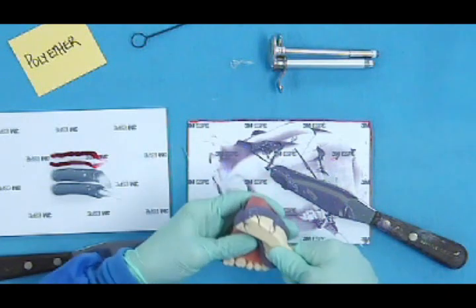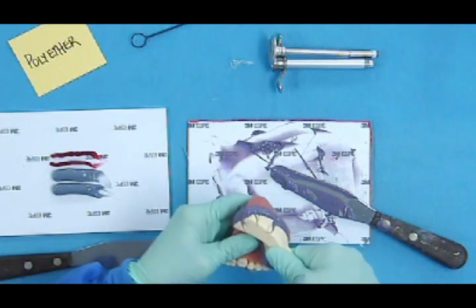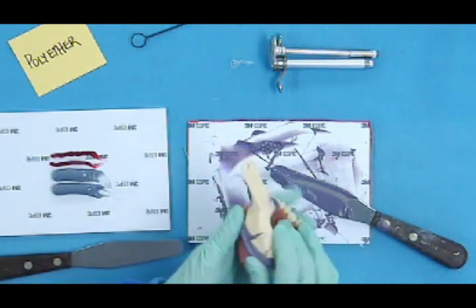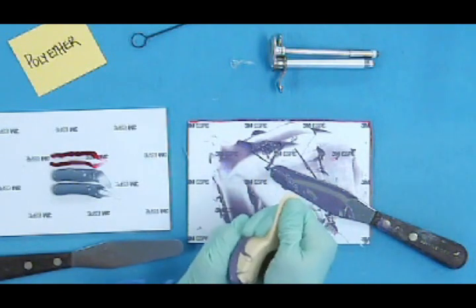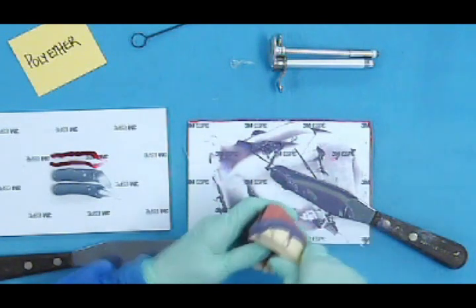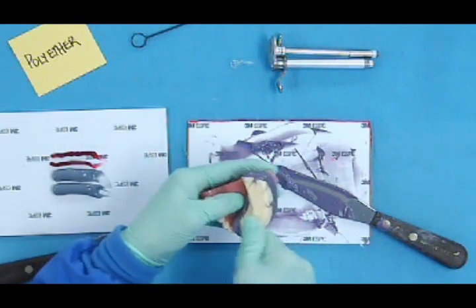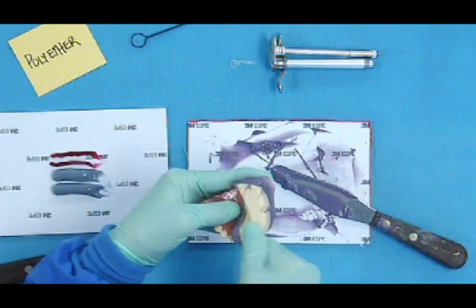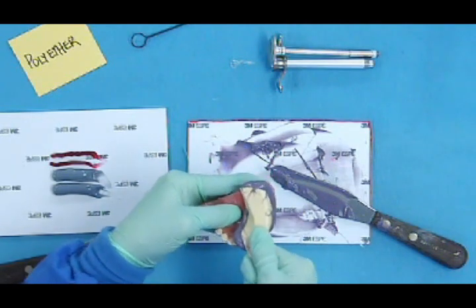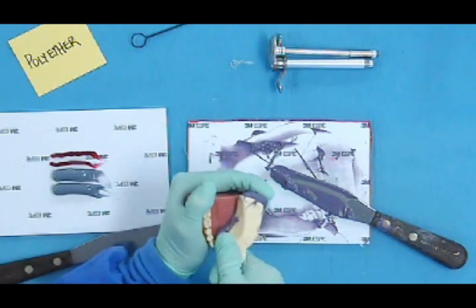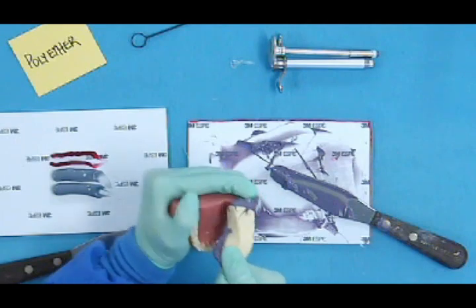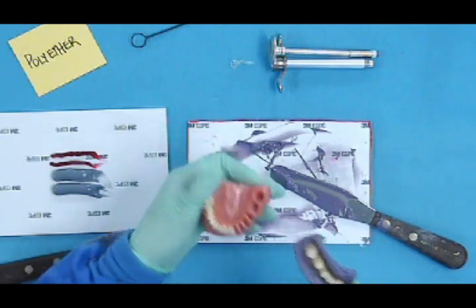And don't be alarmed if some of the teeth off this dental form come out in this material, because it's happened before. But we'll remove it from the patient's mouth easily, carefully. And all the teeth came out.